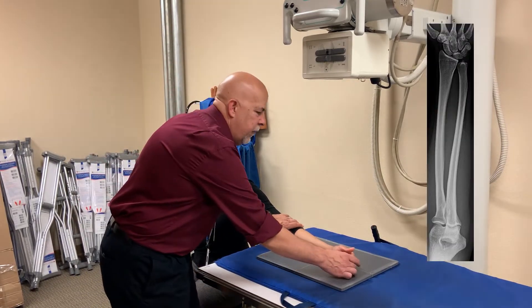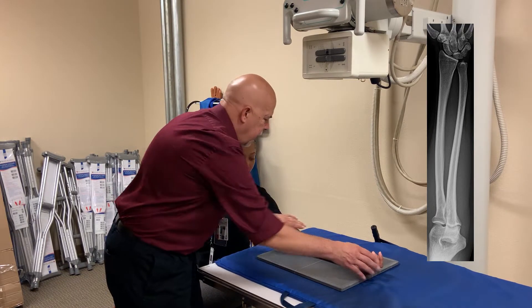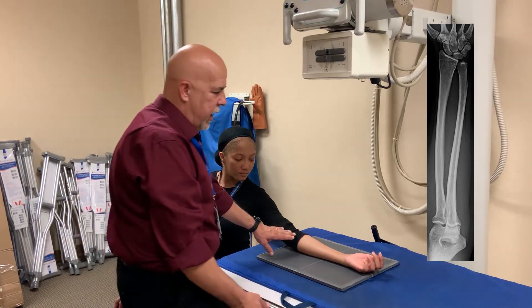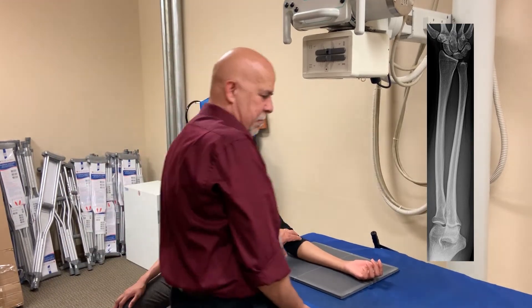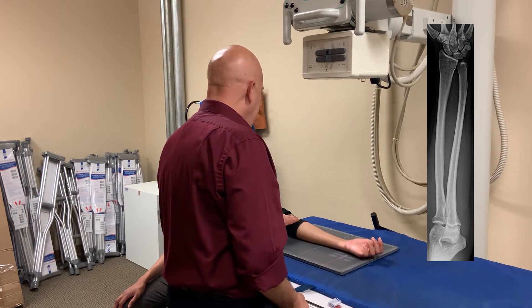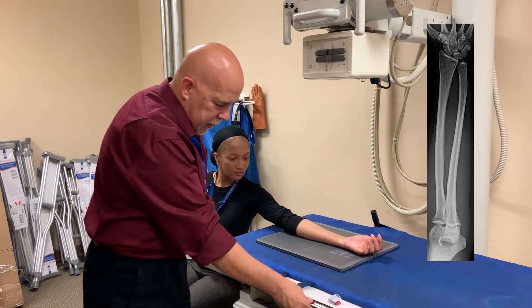So we're going to position Nikki for an AP. It's just straight out in the center, but we want to make sure that her arm and her shoulder are in the same plane. So we can raise the table up. She's all in the same plane, and we can flip the table around.